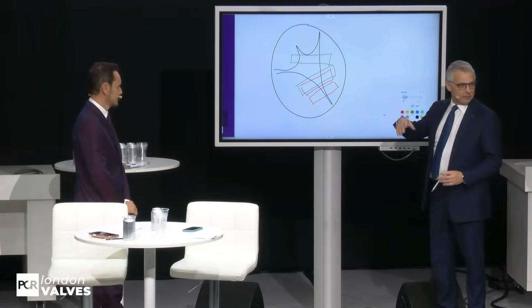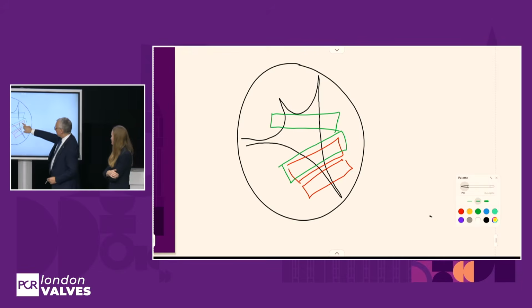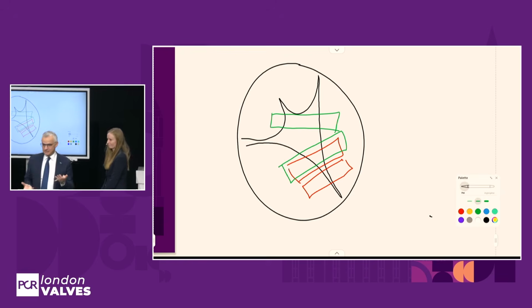Anyhow, in my mind, when we have this discussion, the red clips are easy, the green ones are difficult. No, the red clips are probably less effective and the green ones are more effective. And as usual, we need to balance efficacy and complexity.